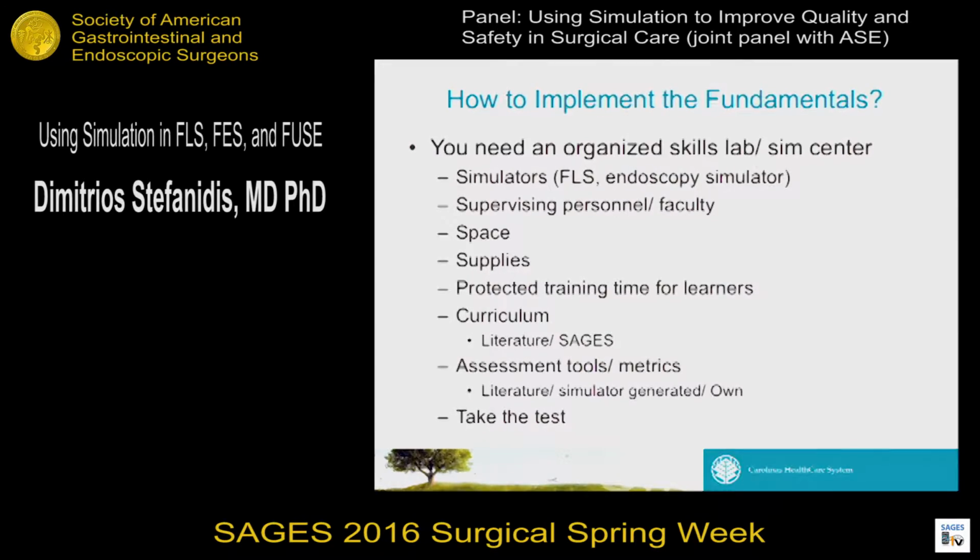SAGES provides a lot of research along those lines. And of course, there are also assessment tools and metrics available that you can incorporate into this process as you're assessing the skill of your learners to make sure they're getting to where you want them to get in their abilities. And of course, there's also the opportunity to take the tests, FLS and FES, to demonstrate your competency.